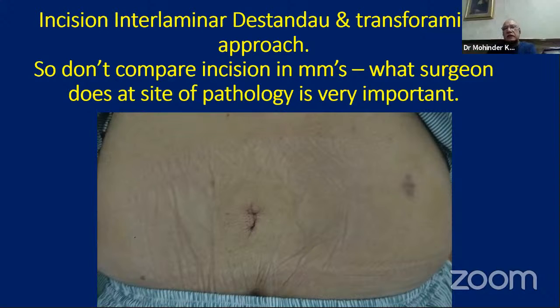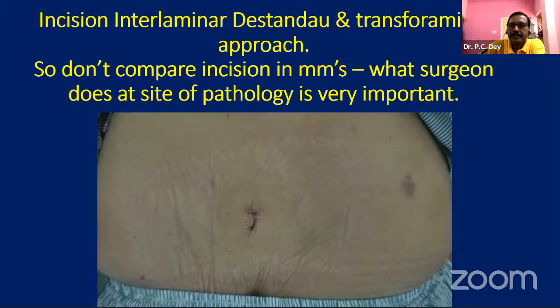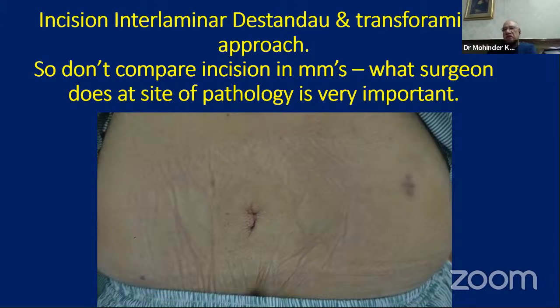Yeah, I think small incision, cosmetic incision is even a patient's requirement also. If you see how microscope came into being from open spine surgery, that was, I think it is a quote of Dr. Srinivasan only, that there were bar girls who were very much impressed with big scars, incision on their spine. So microscope brought in the small incision and endoscope further brought in the small incision.